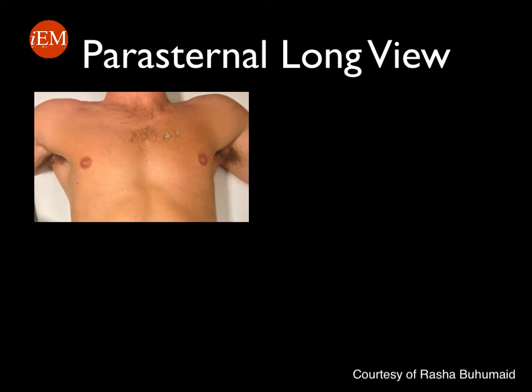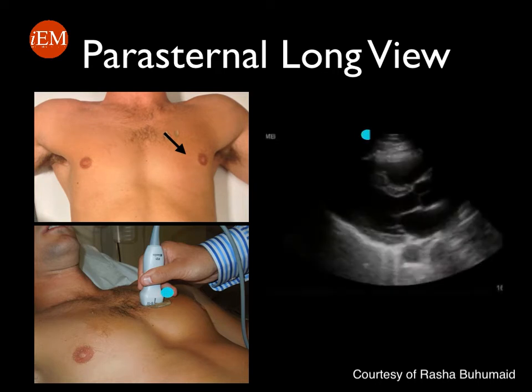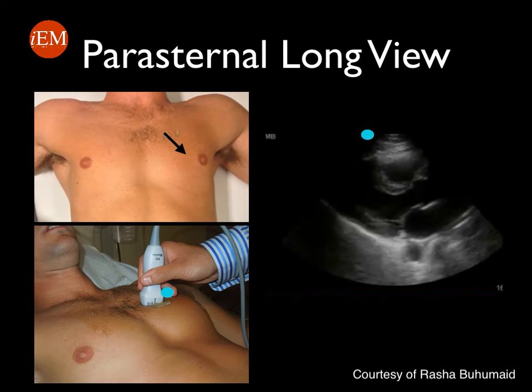The parasternal long view is obtained by placing the phased array probe in the anterior chest wall between the third and fourth intercostal space. The probe marker will be pointing towards the patient's left hip. This is the ultrasound video that corresponds to a normal parasternal long view.